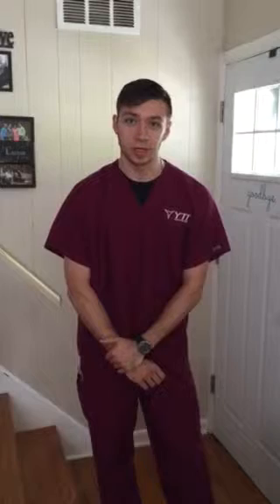condition. Some contraindications: a patient cannot be instructed or supervised. A lot of patients that know they're not being watched will refuse to do it, and this is bad for the patient and will further lengthen their stay at the hospital. Or a patient will not cooperate or is unable to understand or demonstrate the exercise. And presence of an open tracheostoma. It's not a contraindication, but you just have to adapt so the patient can use the exercise.